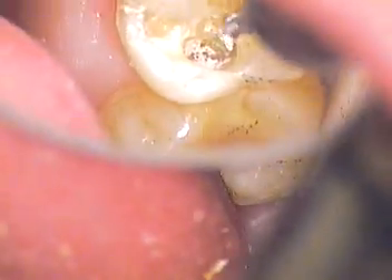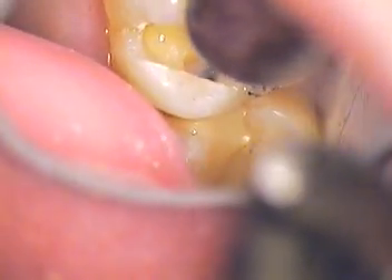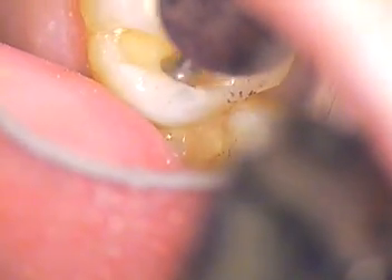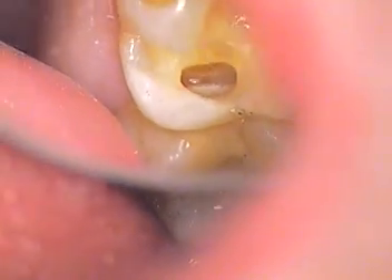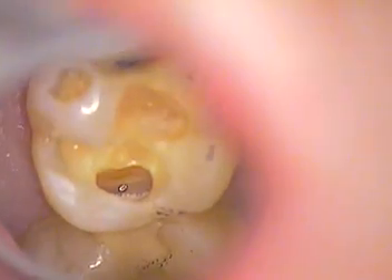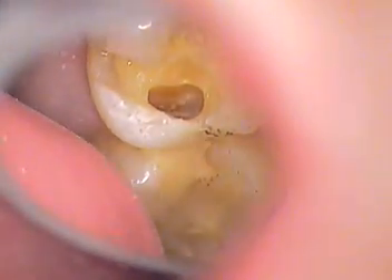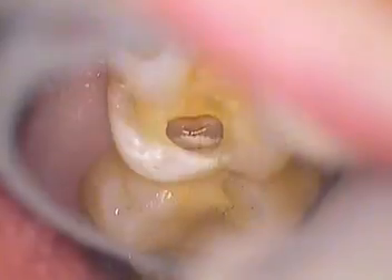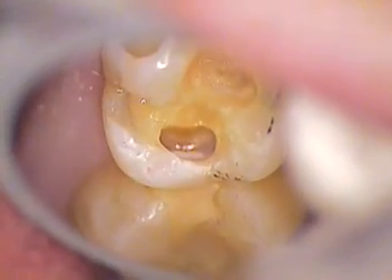A little water with that, Maria. Am I doing all right? Excellent. I'm going to take a good look at that distal aspect. You can see how that's all materialized on the inside.